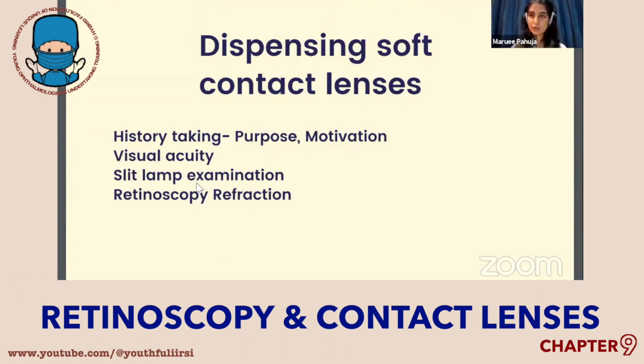Then seeing the visual acuity and how much improvement happens with the previous glass prescription, and what is the uncorrected visual acuity of the patient. Doing a thorough slit lamp examination so you know that when the lens goes in the eye, it's safe. And then, of course, a retinoscopy refraction and a keratometry reading.